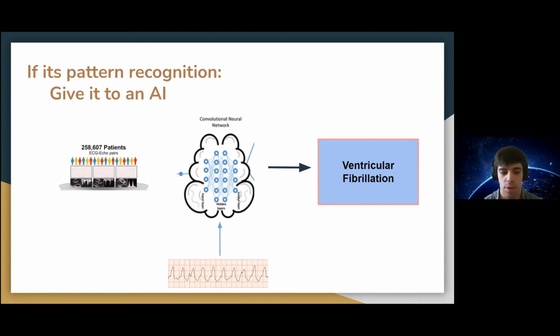And once we input our third graph, it wasn't actually 1 degree of separation away from the healthy heart. It was a different disease. It was ventricular fibrillation or ventricular tachycardia.